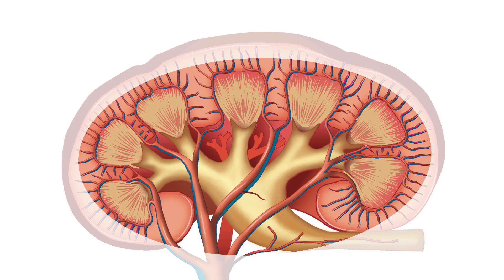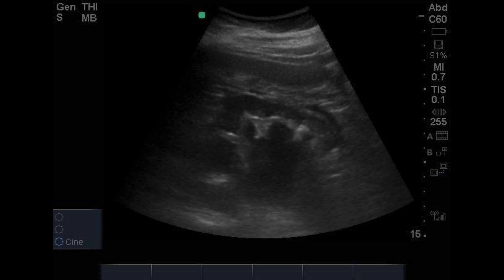Severe hydronephrosis means the collecting system is dilated up to the level of the renal cortex with thinning of the cortex — extending past the level of pyramids with calyxes starting to become confluent. Here you can see severe hydronephrosis where dilation extends past the level of pyramids and the calyxes are becoming confluent. Remember that hydronephrosis is a gradation between mild, moderate, and severe, and there is limited inter-rater reliability — sometimes people will call something mild while others call it moderate, or mild-to-moderate versus moderate-to-severe.